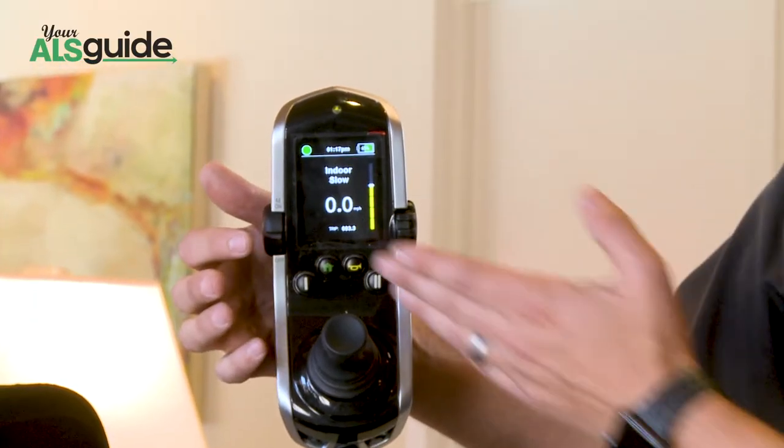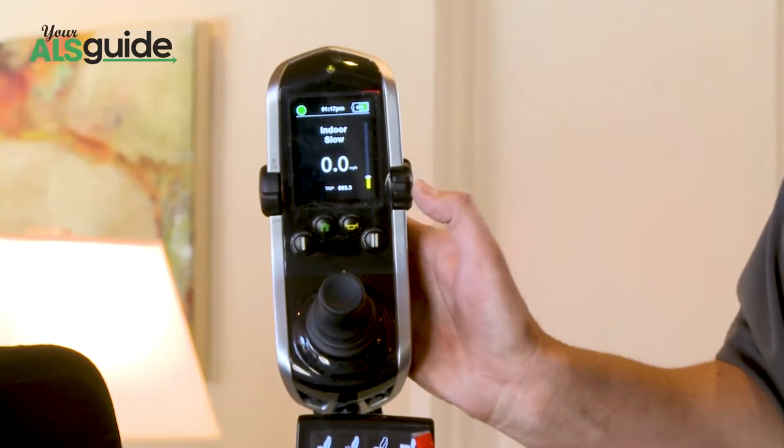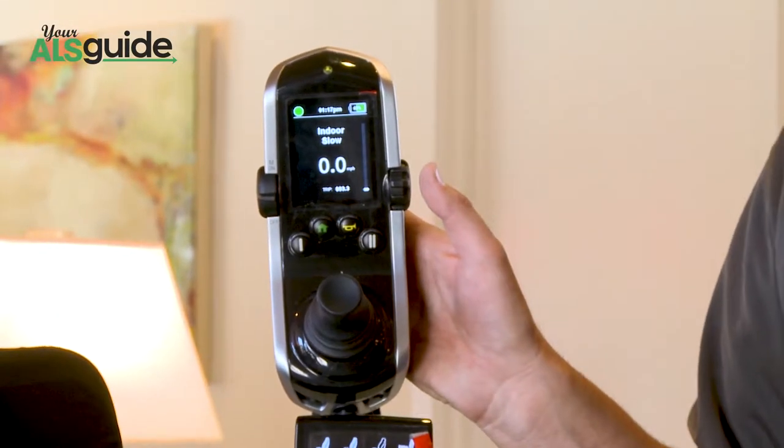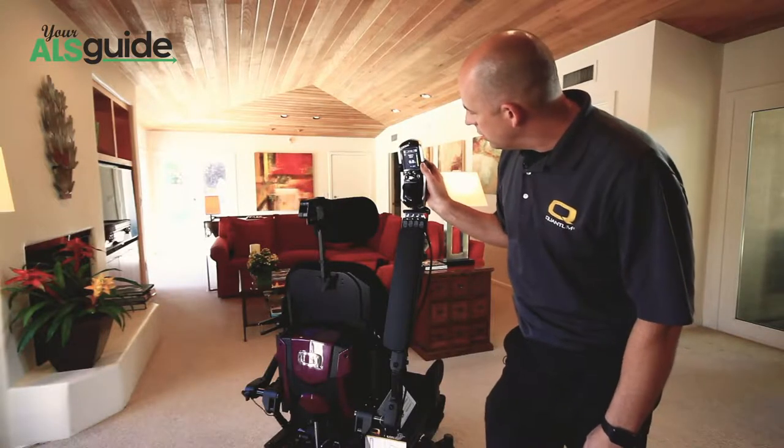And then we also have starting at indoor slow. In each profile, you use this little attenuator, and you can kind of dial in the speeds and make it slower or faster, depending on the situation.